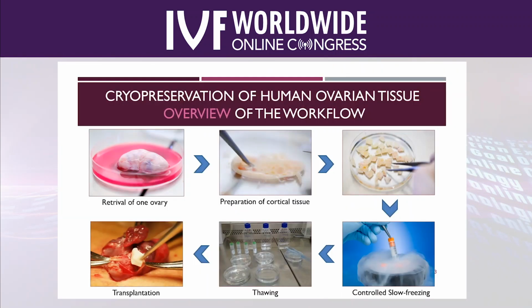This is just a short overview to show you the workflow, the overall scheme. When we retrieve an ovary, we prepare the cortical tissue, and then we freeze these small pieces. Once the patient has survived her cancer and would like to have her fertility restored, we can thaw the tissue and retransplant some of it and give her a chance to mother a biological child.